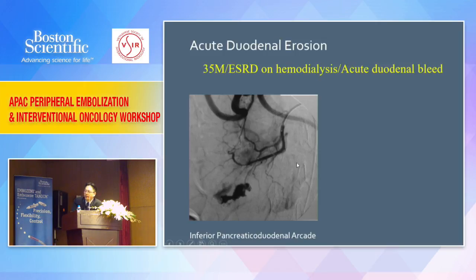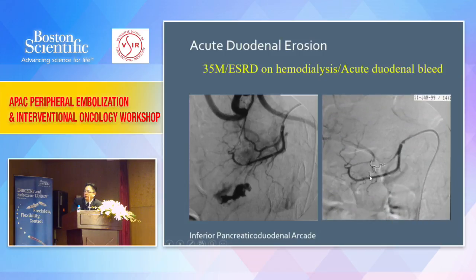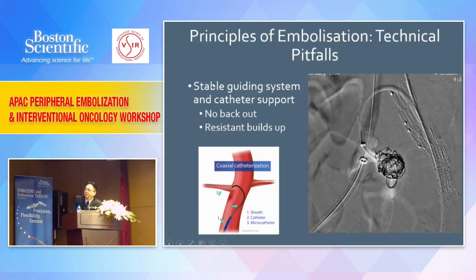In a situation like this, you really need to go into the artery which is bleeding, the peripheral point source bleed, because the collaterals will come in. You see that we really go into that point, and double block back door and front door. Only then do we achieve the embolization. And usually do a few oblique runs to be sure that we are in the correct vessels. Otherwise, if you just block here, in the wrong territory, it may cause major complications.